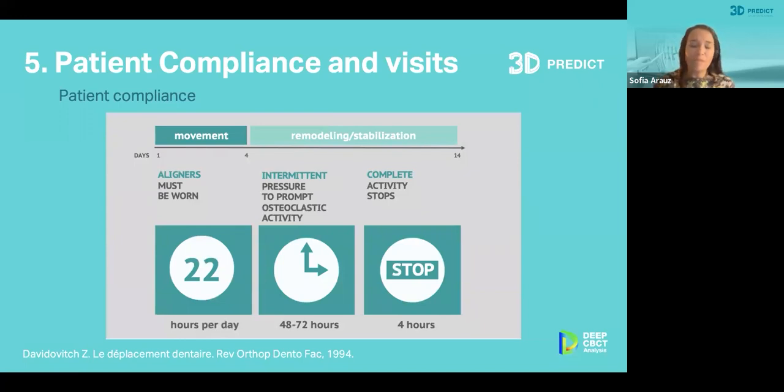We will want to make doctors happy by saying every 7 days. Obviously, treatments go faster, but that's actually not scientifically sound advice. Based on publications we have reviewed, it is clear that the best, most predictable outcomes are when your patient is wearing those aligners for 14 days, and they're wearing them 22 hours per day, minimum 20 hours per day, and they are not lowering that number.